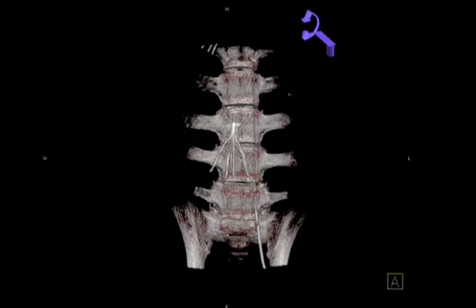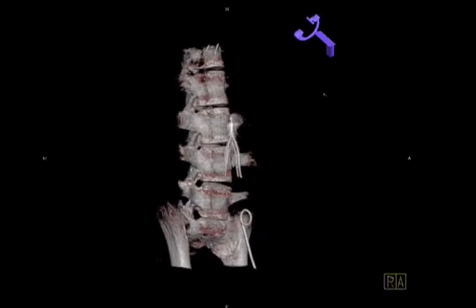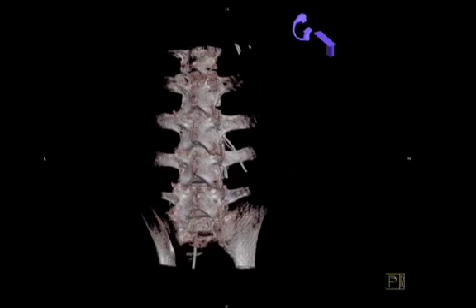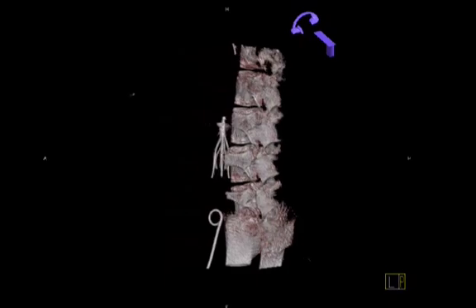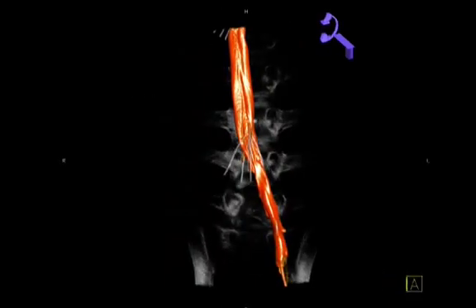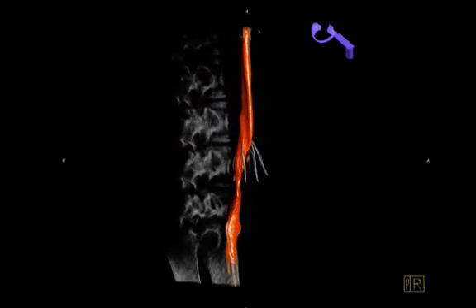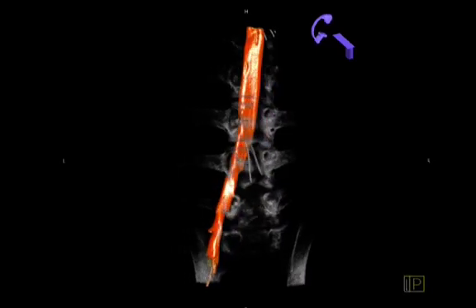In this situation, retrieved in the porcine model, we used 3D imaging to actually evaluate the position of the filter prior to retrieval. This is particularly useful especially when the filter is not centered appropriately. We've seen bony protuberances which precluded capture of the tip of the snare. The porcine model is fairly representative — sometimes you even get penetration of the legs of the filter, as can be demonstrated here using intraoperative cone beam CT scan.